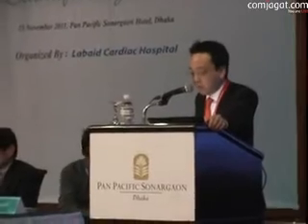Second, there's a reduced stent strut thickness, as I told you before. Third is more biocompatible polymer. There's a fluorinated copolymer that is used with the Xience stent. There's also the BioLinx polymer used for the Resolute stent. Fourth, Boston Scientific will incorporate all bioabsorbable polymer technology instead of the biostable polymer technology used in the second generation DES.